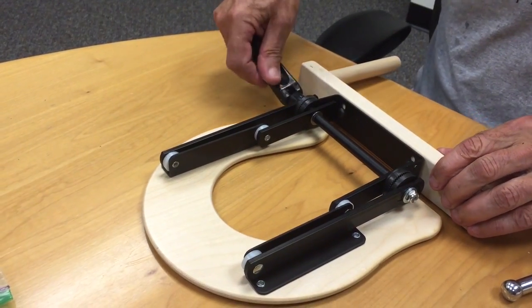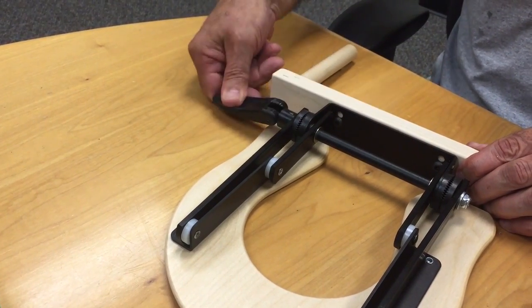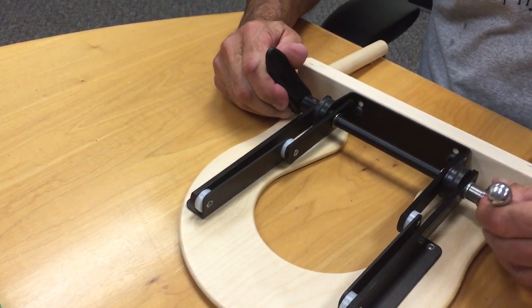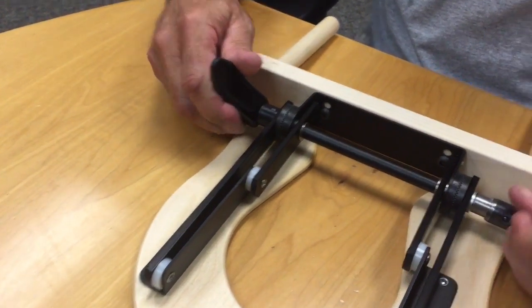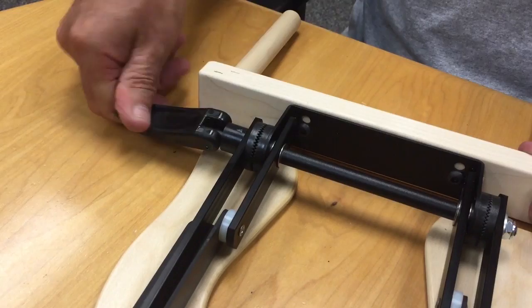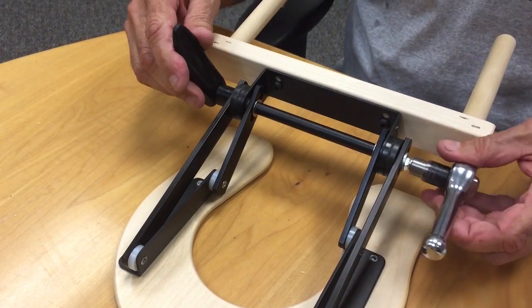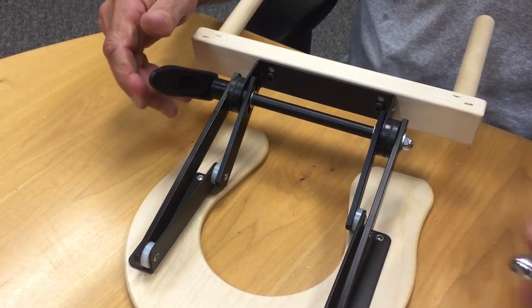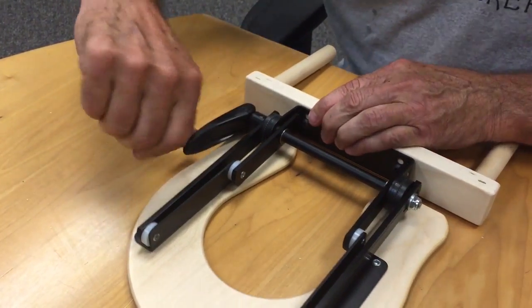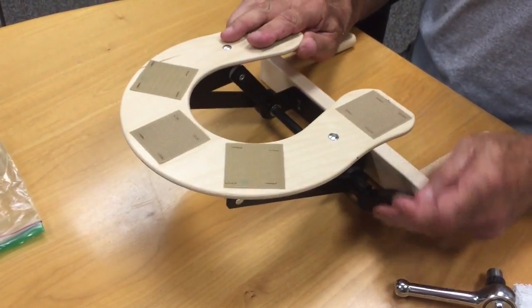You must put the handle in that position, which as you can see collapses everything. Then you would tighten until you see all the play out of the teeth. And there you have a freshly repaired Posi-Tilit FaceRest.